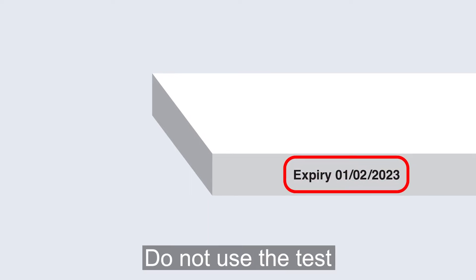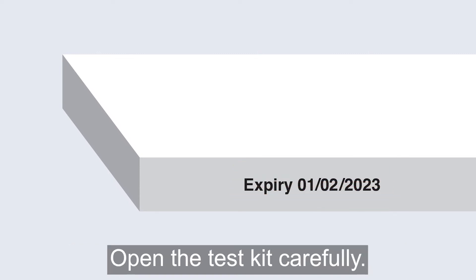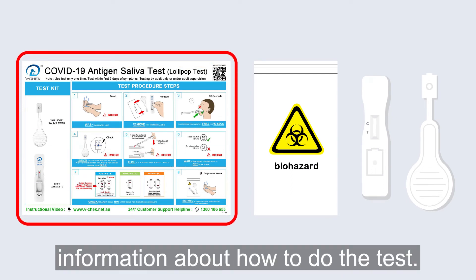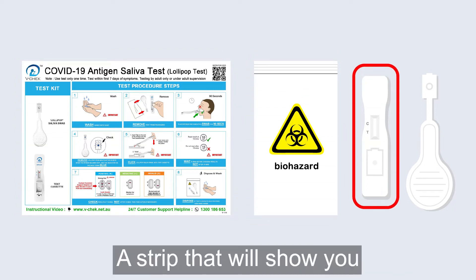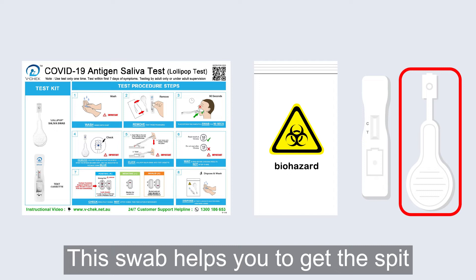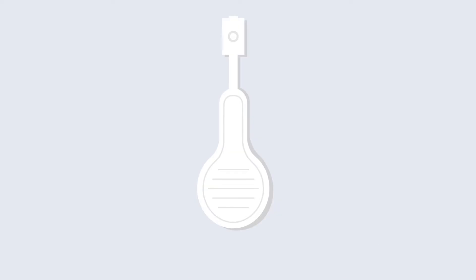Check the date on the box with your test. Do not use the test if the expiry date is already over. Open the test kit carefully. In the box should be: information about how to do the test, a grey rubbish bag, a strip that will show you if you have COVID-19 or not, and the lollipop saliva swab.